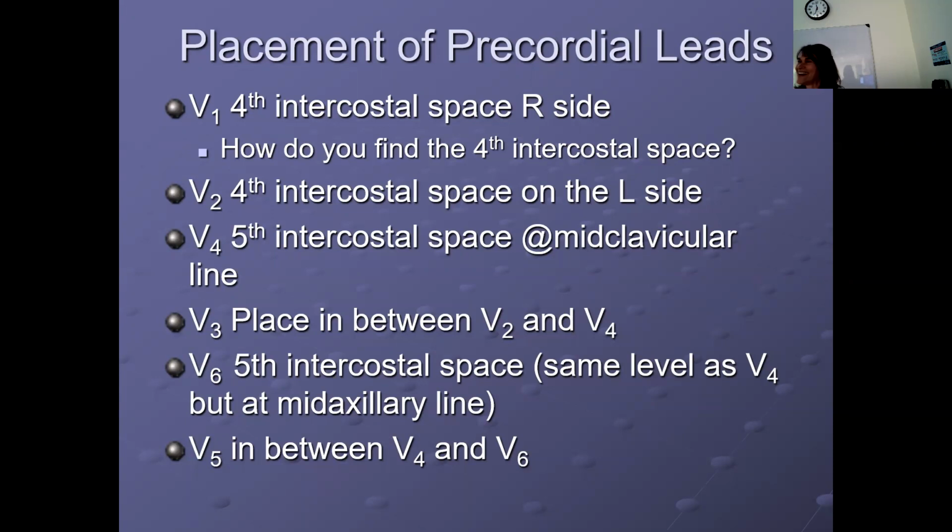And here you are. So yes, the first time I ever did it, I was at an EMT training with the city of Miami. We went to this house and we had to do an EKG in someone's house, and this giant woman. I made a mistake. I had to move breast tissue, and I palmed it. The guys didn't say anything until we got back to the truck. Like, yeah, man, you don't do it that way. So you move it with the back of the hand, but explaining what I did.